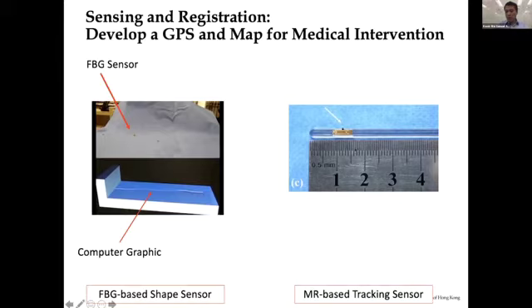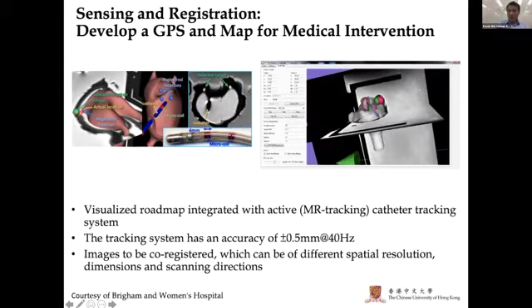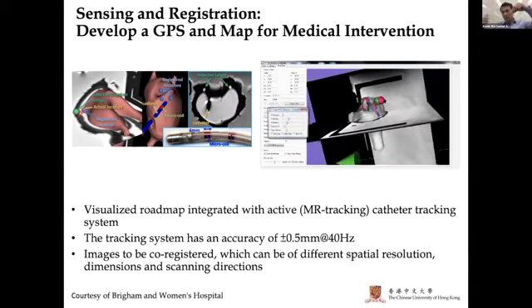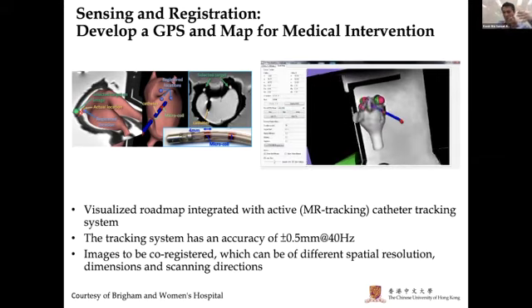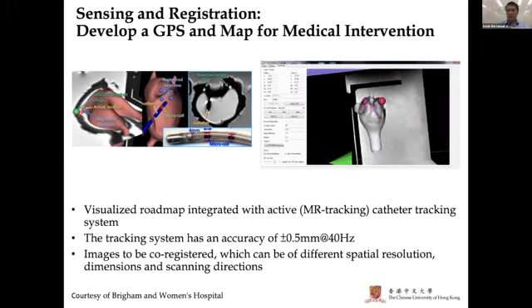In the meantime, I also work with my collaborator from Hong Kong U, Professor Gawei Kok, on an MR-based tracking sensor. We designed our own tracking sequence. We can monitor the position of the system based on the coil location. This is one of the videos of our real-time MR-guided measurement. In this particular video, we have a special coil and special sequencing technique on the MRI system so that we can monitor in real time the location of the flexible instrument, based on MRI interaction with the coil embedded inside the hardware. The accuracy is pretty high and it also has a very high bandwidth. This creates the so-called GPS, combined with the map, which is necessary when we do flexible robotic navigation.